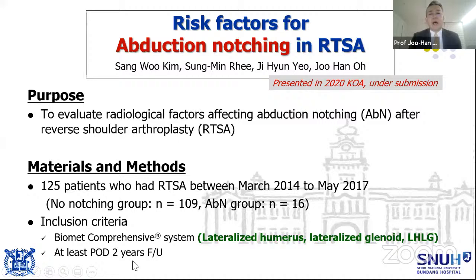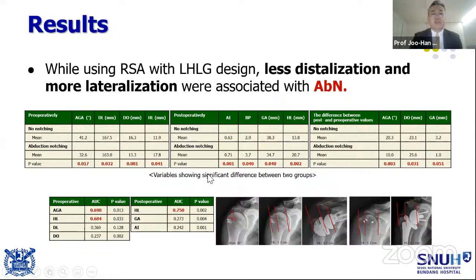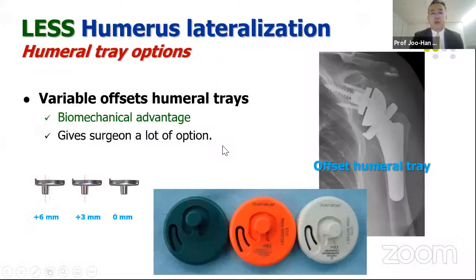So I reviewed more than 100 of my patients with lateral offset implants, and I made several measurements with pre and post-operative x-ray sets. According to my data, abduction notching was related to less distalization and more lateralization in the lateral implant. So if the patient has a preoperative acromial GT angle smaller than 35, or humeral lateralization of more than 1.5 centimeters, there is probably a high risk of abduction notching. In those patients, we had better use an offset humeral tray to reduce the lateralization.